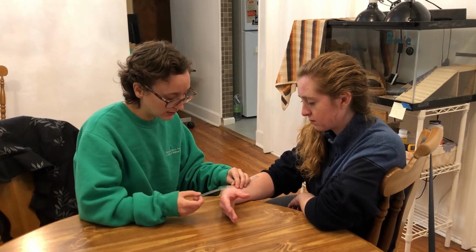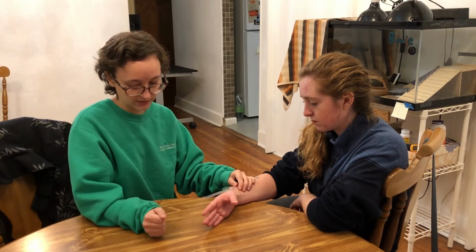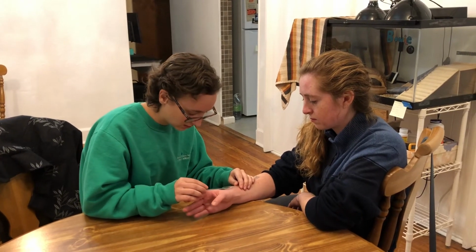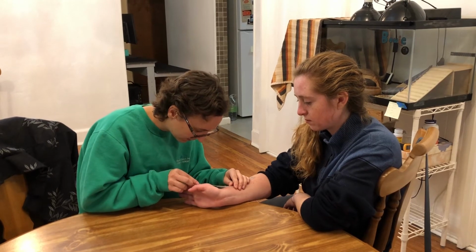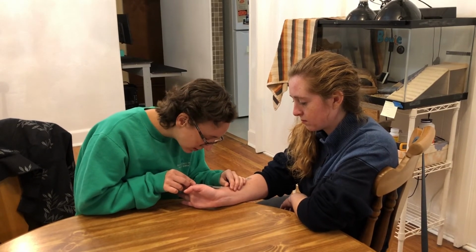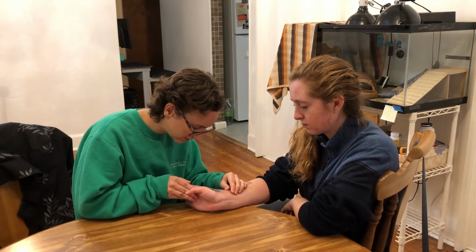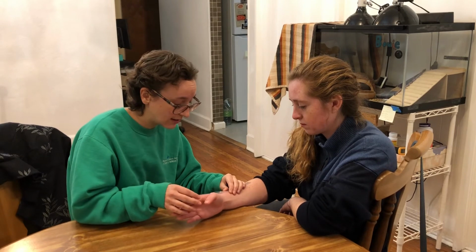Okay, and now we're going to come back to the middle here, because we're going to do the same thing, but this time I'm going to have you bring your hand back for extension of the wrist. So go ahead and do that. Fantastic. Okay, and for that, I'm getting about 65 degrees. So I'm going to go ahead and see if I can bring you passively a little further. Fantastic, and I brought her passively to 70 degrees. So this is range of motion of the wrist.